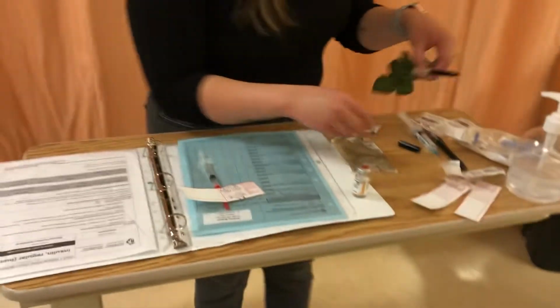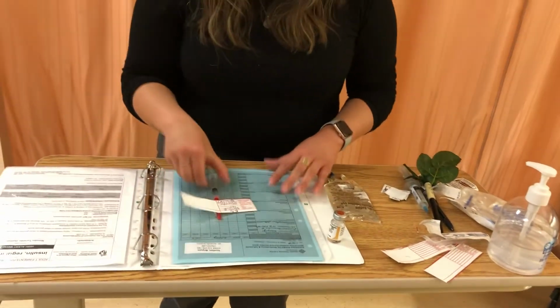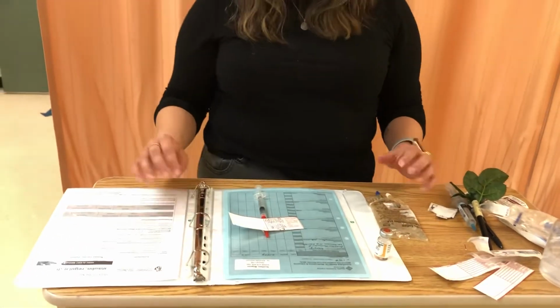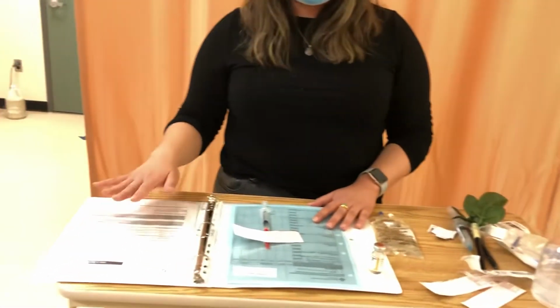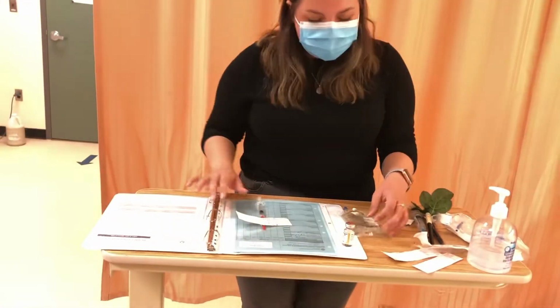Since I need 10 mLs of medication, I will be using a 20 mL syringe. So now that I've prepared this, I can go ahead and complete my second check. It is important to note that at this point, I will need a second nurse to complete an independent second check after I have completed my own second check. So I'm going to go ahead and start this.